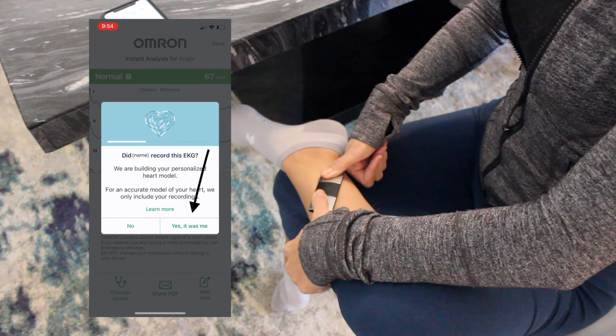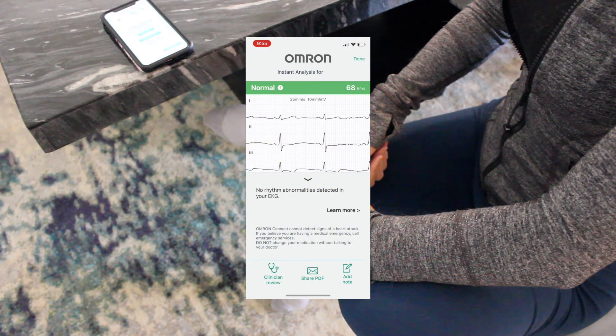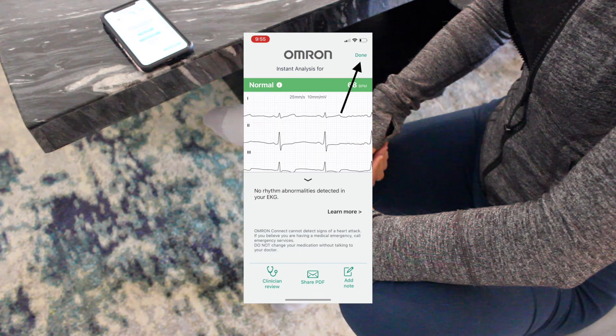And you're done. The next page will show you your reading and tell you if anything unusual was detected. Press done at the top of the screen to be taken back to the home page.